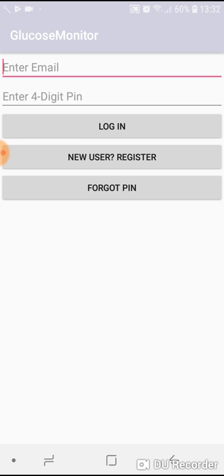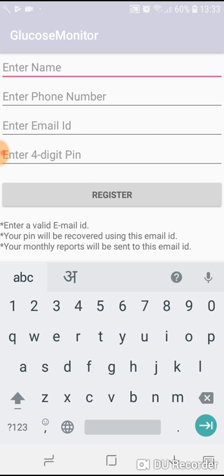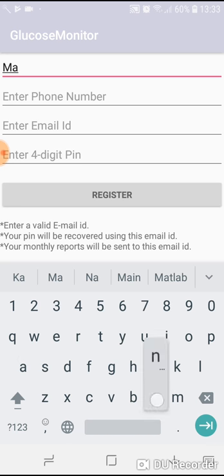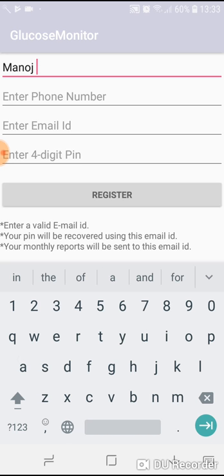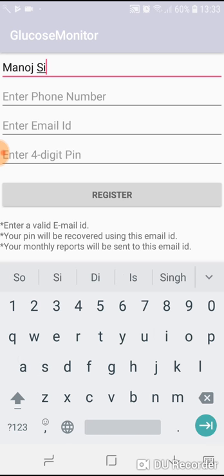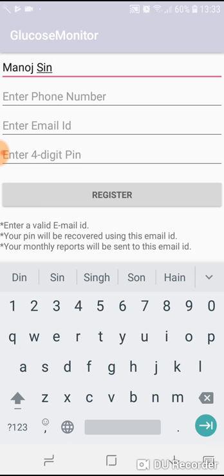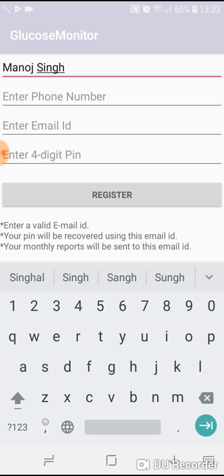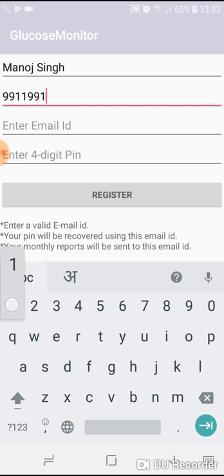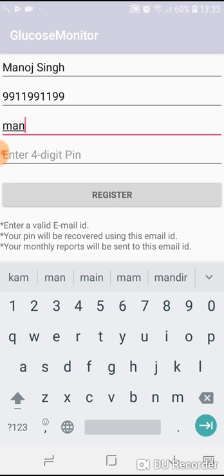I'll register myself - let's say Manoj Singh, then phone number, then email ID. Please remember that email ID has to be a valid one because your monthly reports will be sent over this email ID. Plus, in case you forget your four-digit pin, then this pin will be mailed to your registered mail ID.